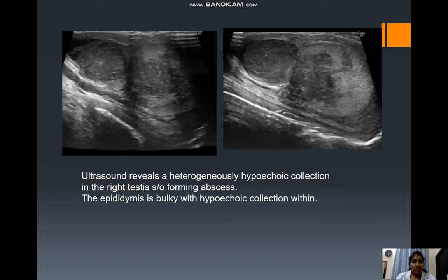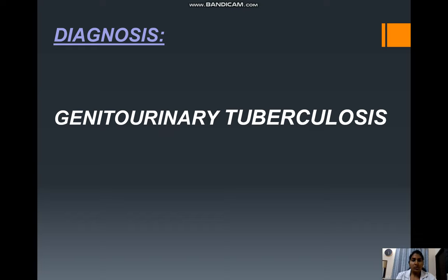In male patients, we also need to look towards the testes. Ultrasound findings may reveal heterogeneous hypoechoic collection in the testes suggesting abscess formation, with bulky epididymis and hypoechoic collection within it. The final diagnosis of the above images reveals genitourinary tuberculosis.